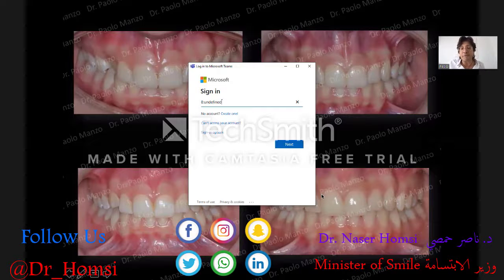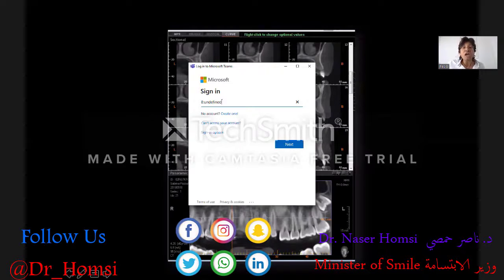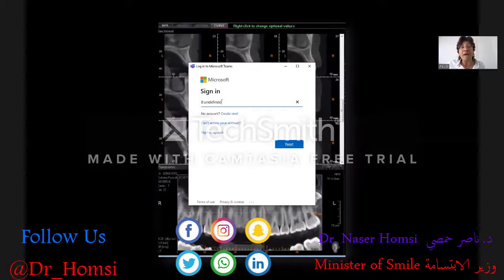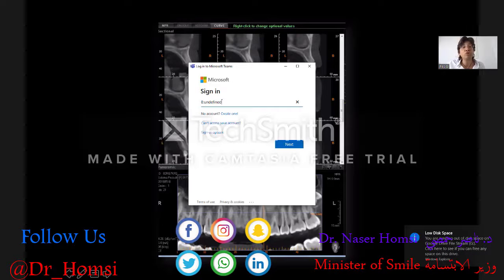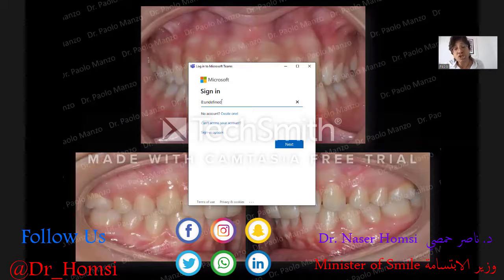You can see the position of the upper right canine now. It is very well corrected. We didn't touch anything. We didn't touch the class relationship, the molar relationship, the canine relationship on the other side. And we have full control of the bone level on the right side that is possible to compare with the left side. It's quite the same, okay? So we also have a confirmation of good torque control on the canine. Now, this is the final situation. The level of the gingiva and the positioning of the canine are going to heal even more, but the anterior relationship didn't change.